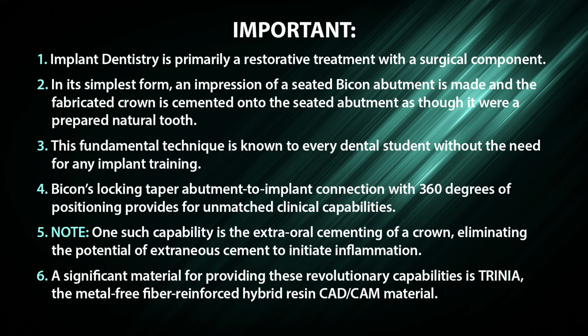Bicon's locking taper abutment to implant connection with 360 degrees of positioning provides for unmatched clinical capabilities. Please note that one such capability is the extra-oral cementing of a crown, eliminating the potential of extraneous cement to initiate inflammation. A significant material for providing these revolutionary capabilities is TRINIA, the metal-free, fiber-reinforced, hybrid resin CAD/CAM material.